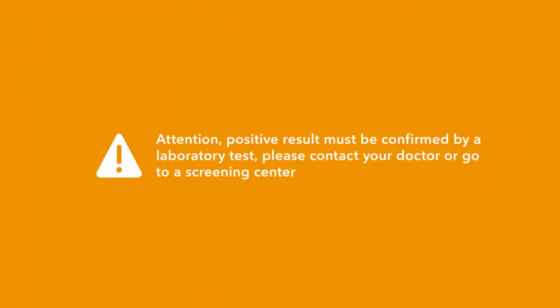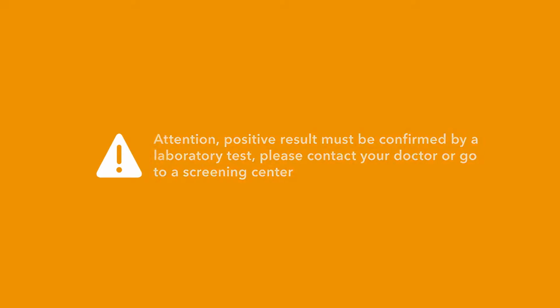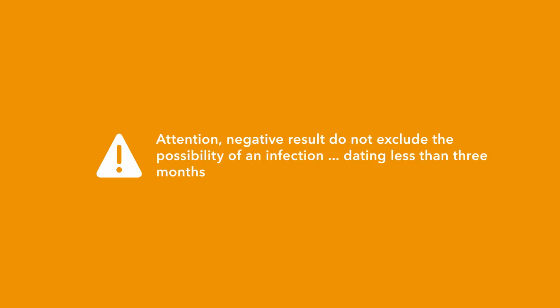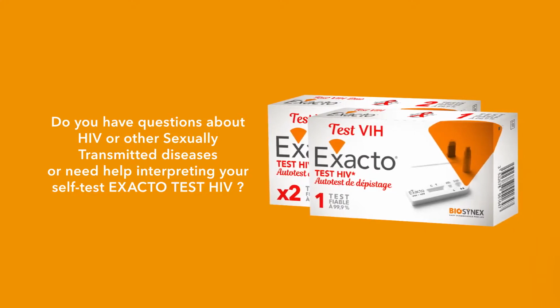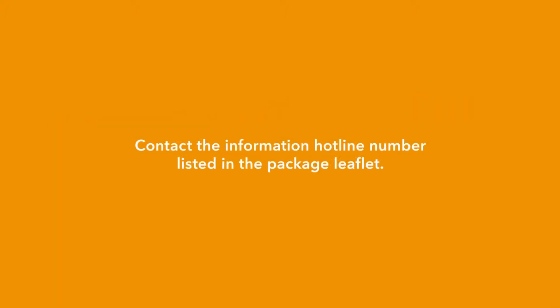Attention! A positive result must be confirmed by a laboratory test. Please contact your doctor or go to a screening center. Attention! Negative results do not exclude the possibility of an infection in case of risk of exposure dating less than 3 months. Do you have questions about HIV or other sexually transmitted diseases, or need help interpreting your self-test Exacto Test HIV? Contact the information hotline number listed in the package leaflet.